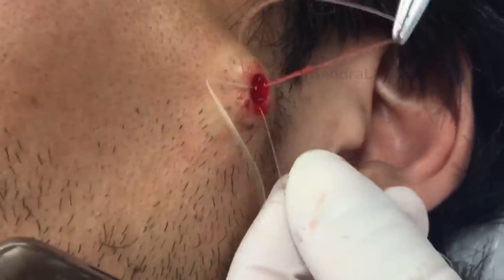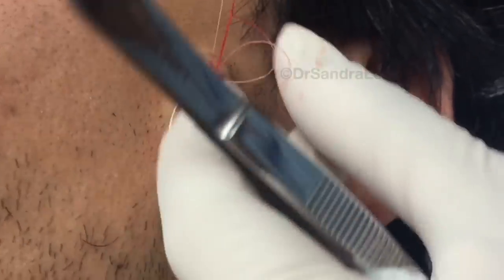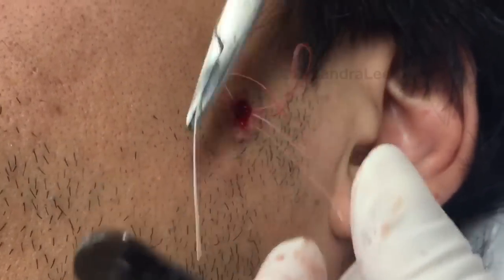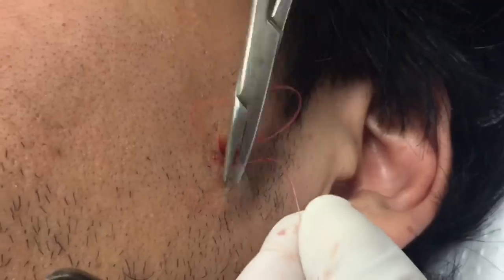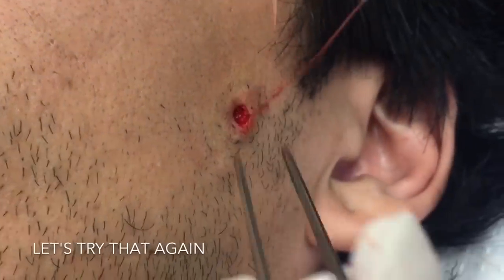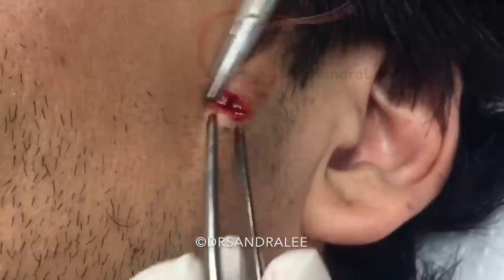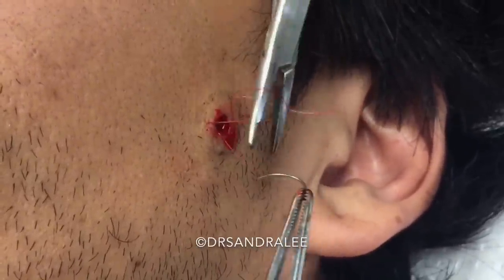You're embarrassed by me, aren't you? What did I do there? I actually put the suture right in the middle of the other suture — do you see what I did there? I'm going to start over again then. Excuse me for a minute, let me just regroup here. Nice and tight for him. If it's a fine line, it increases the chances that it stays a fine line, because I know he likes to talk a lot — you can stretch this little scar if he talks too much. Okay, that's better now.